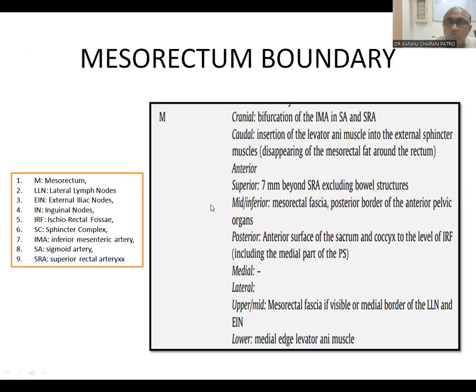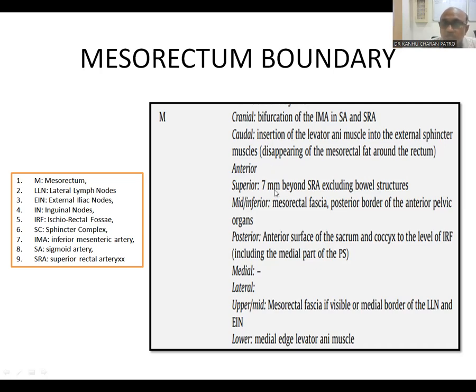So what are the boundaries and how do we contour? The cranial border is the bifurcation of the inferior mesenteric artery into the superior sigmoid artery and superior rectal artery. The caudal border is the insertion of the levator ani muscle into the external sphincter muscle. The superior border is 7 mm beyond the superior rectal artery, excluding bowel structures.